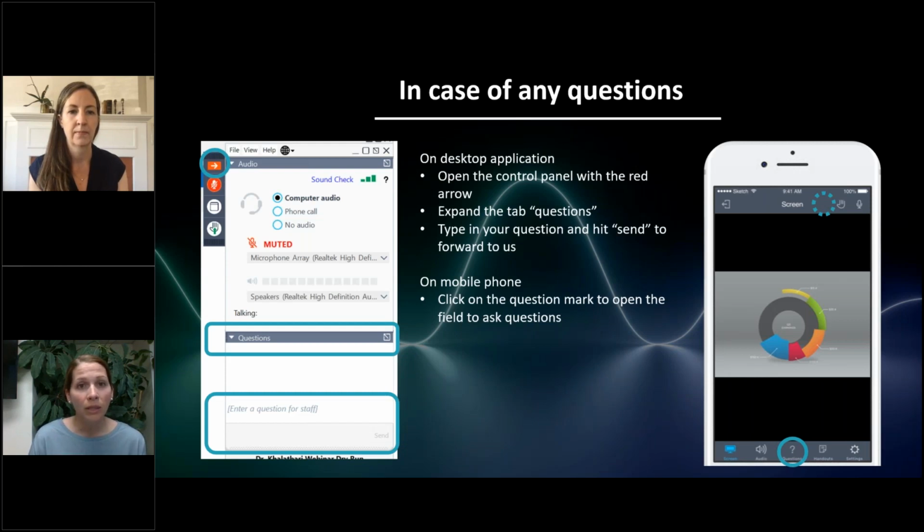Thank you. Next question is regarding VEP, wondering if photopic negative response or pupillometry might be able to give a sense of permanent axon loss versus transient compression, and give a sense of demyelination and remyelination. Using the RETeval and pupillometry might certainly be more practical in a clinic setting than VEP for a large number of patients. Yeah, and I should add that you can use the RETeval to do VEP as well. You just have to hook up the right electrodes to it. I certainly think that all of those are interesting.